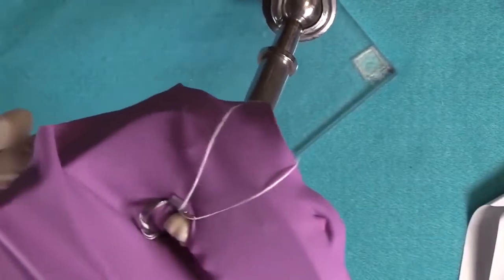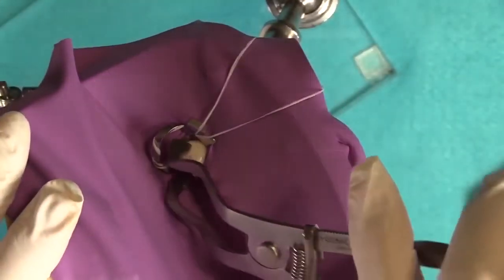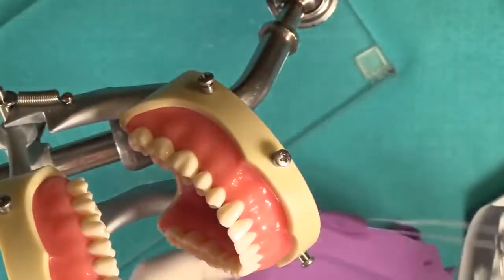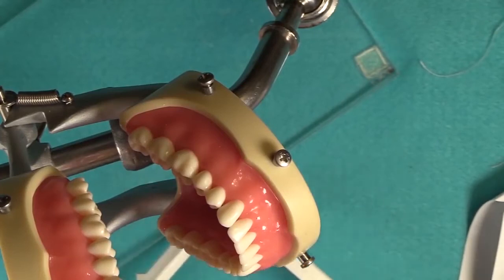That is your wing technique. Now, when you remove your dental dam, it is easy. You just simply insert the clamp forceps into the holes of the clamp, squeeze on the handles, pull straight off, and the dam and the frame come off together. It's always advisable to have the dam and frame come off together.